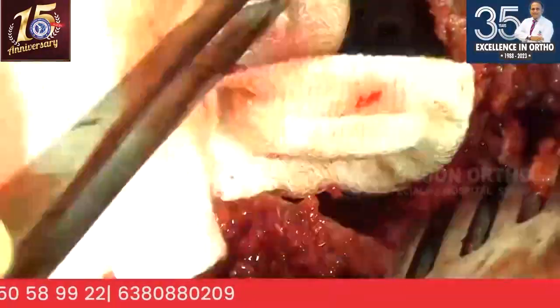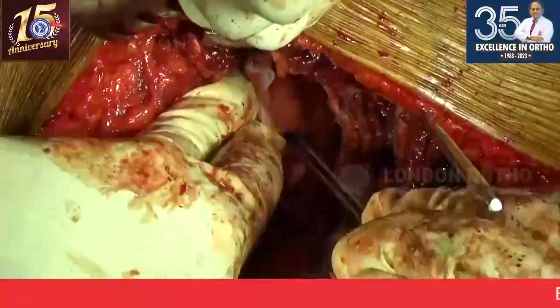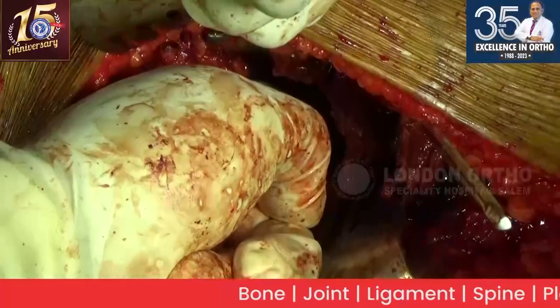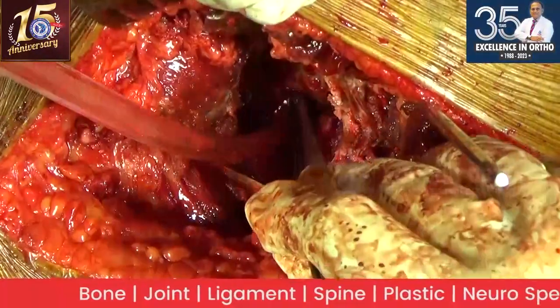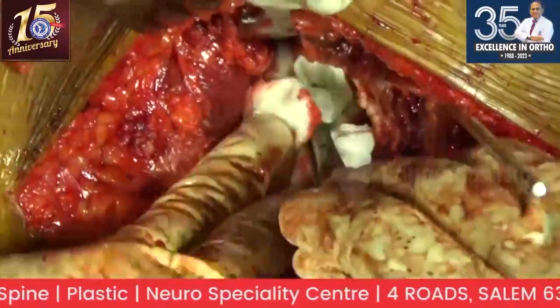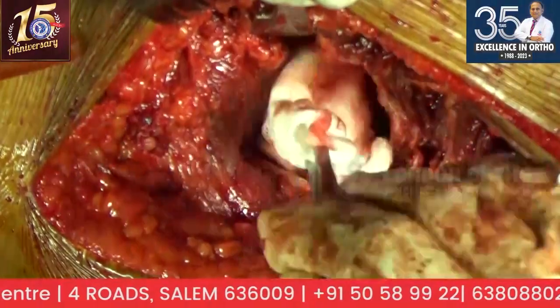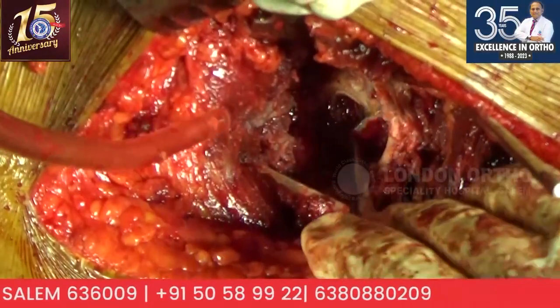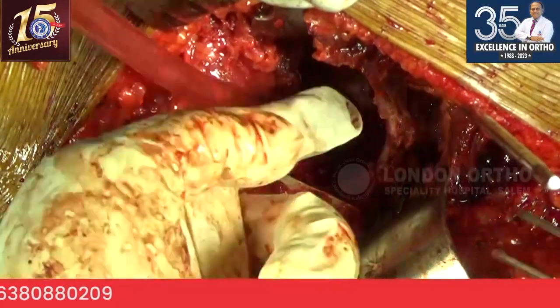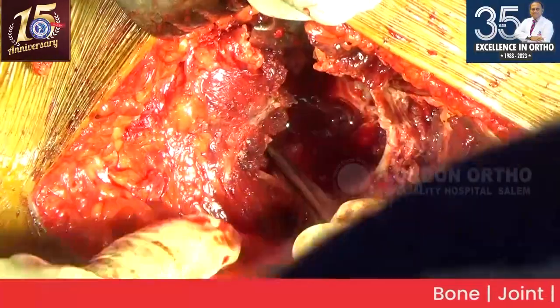Yeah, but see, we are on the medial wall. I'm just a bit worried that a defect in the medial wall becomes a problem. Can you put a K-wire or a drill bit and see how deep that medial is? No, I can feel it with my hand. And it's going in? It's going in. Oh, right, there is a defect. It's like the Mexican cap defect in Chandi. So that's why I'm a bit cautious about not going a bit more medial. See, up to there is fine. There's 1 or 2 millimeters, but after that it goes in. I can even feel it with my hand. It's about a 5-6 millimeter defect.